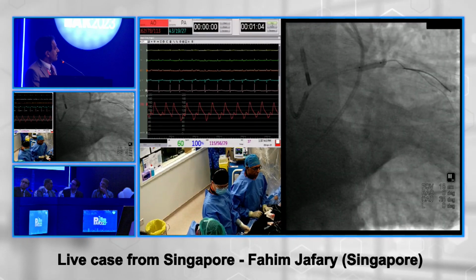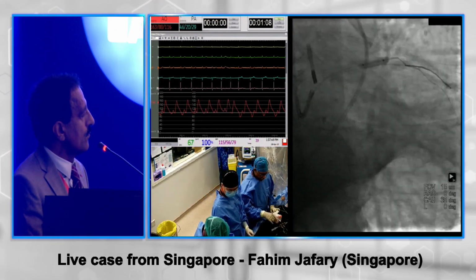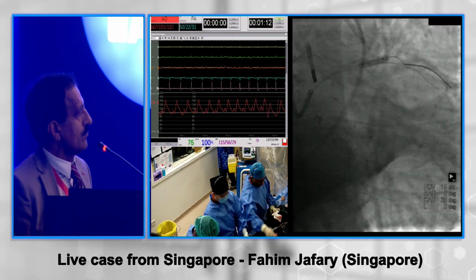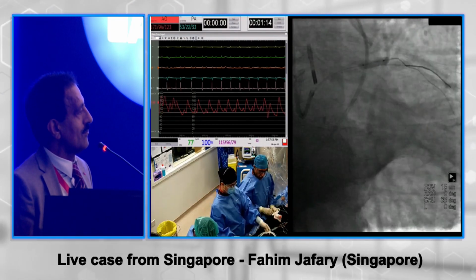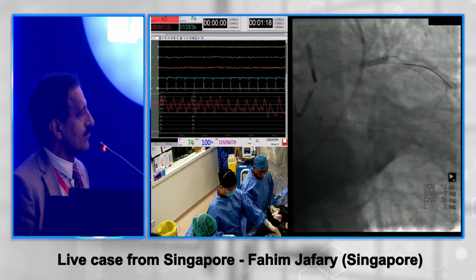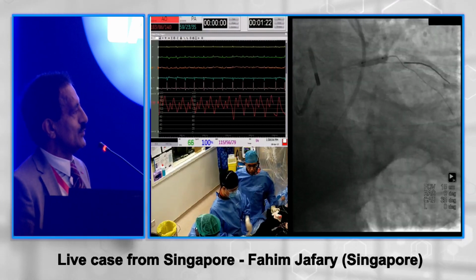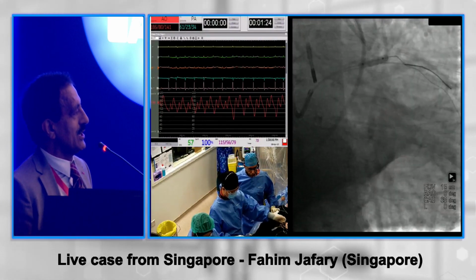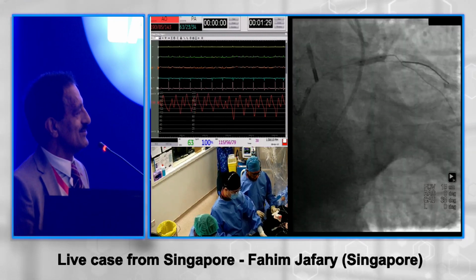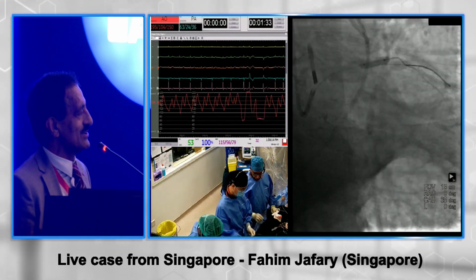While we're getting the IVL ready, maybe I can ask the panel for your thoughts on, or Ashok, your thoughts on using OPN in this situation. We used to use it a lot in the past, and now the pressures of 50 atmospheres do worry us a bit. But I'd love to know what the panel's thoughts are on that. Nadeem, what would you do at this stage? Would you consider using OPN, or just, we don't have IVL unfortunately, but what would be your strategy if you were doing it with the limited things we have?